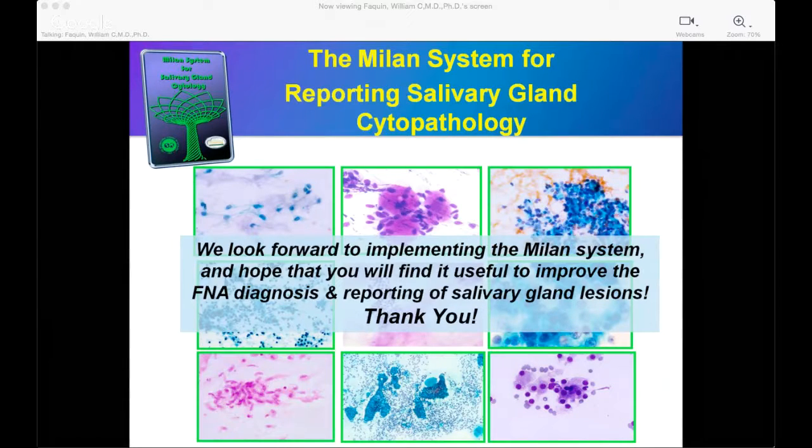And in particular, if you see the presence of keratin pearls and no features of marked atypia, such as with squamous cell carcinoma, but keratin pearls and very bland squamous metaplasia, that is actually not an uncommon scenario in a small subset of pleomorphic adenomas that are basically mimicking skin adnexal differentiation. And so when I see that combination, it's a lot easier to recognize it as squamous metaplasia.